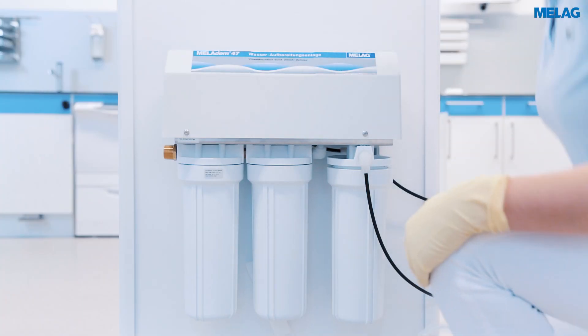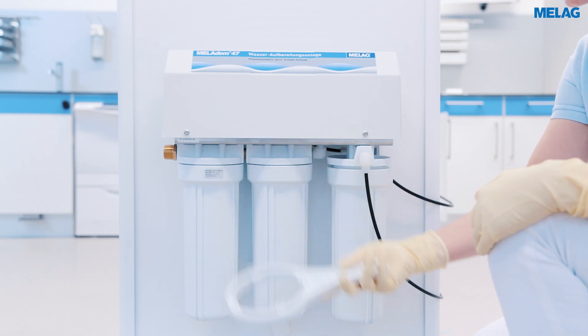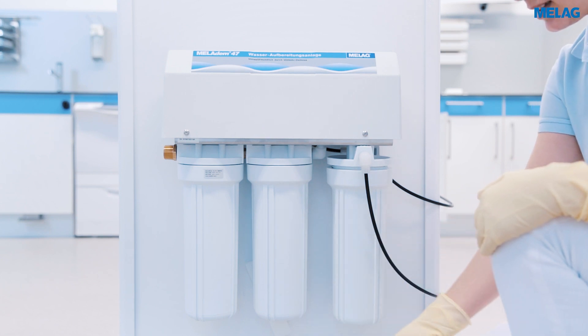You can now use the key to open the cartridge container on the outside right. Guide the key over the container from below and turn it clockwise.